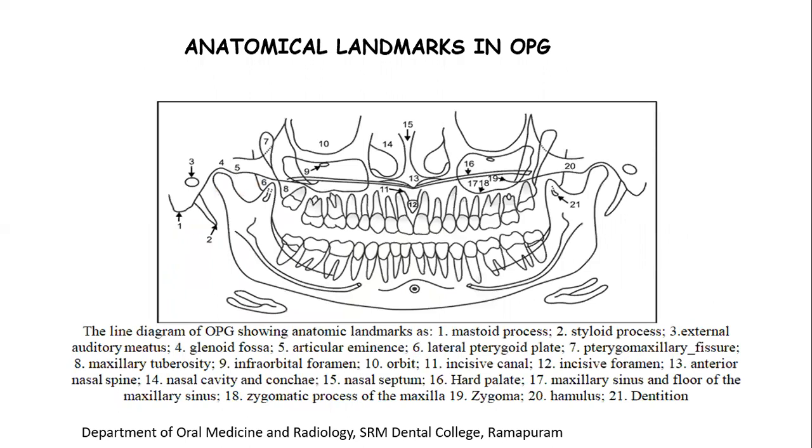These are some of the anatomical landmarks that are seen in an OPG. A schematic line diagram is shown. Almost 21 landmarks can be visualized using an OPG.